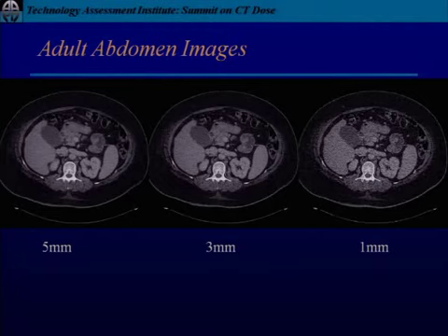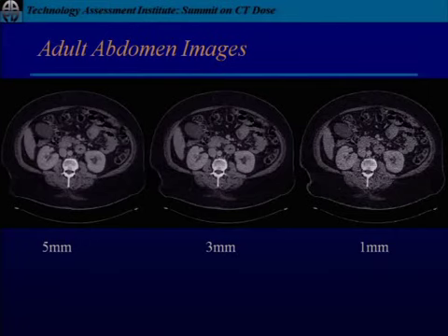And here we are a little bit further down in the liver. I hope you can really appreciate the difference, if nothing else, in the confidence that the radiologist is going to have determining whether there is something unusual in that liver when we go to these really thin slices, when we're just looking at them cross-sectionally. How about down in the kidney? I saw this little hypodense region here. I had a little trouble finding it here, and I was really lost when I went to the really thin slices. Again, a non-contrast abdomen. Contrast would help, but I just wanted to illustrate the effects of the slice thickness here.